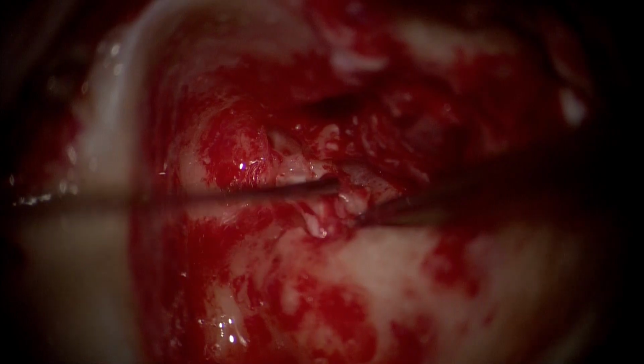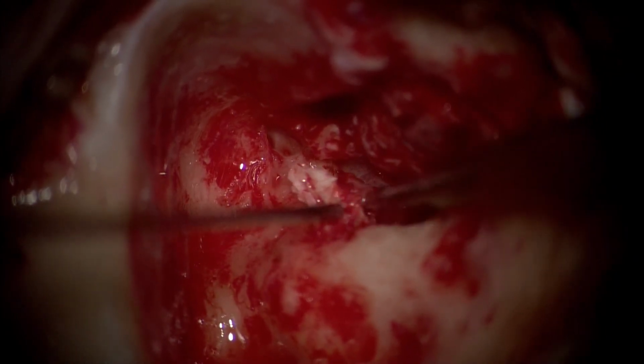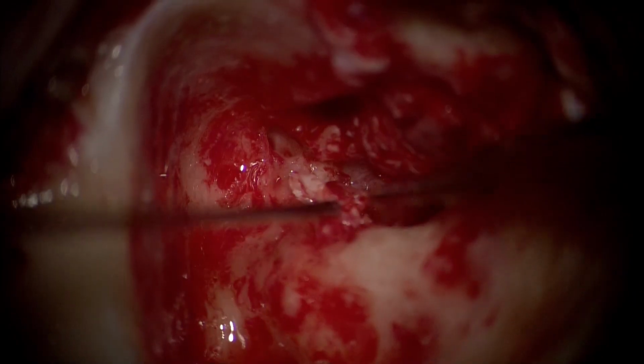This is to avoid traumatizing both the facial nerve as well as the oval window, because if inadvertently you use too much pressure or traction on the stapes region, then an intact footplate or intact stapes head can simply give way into a footplate fracture or, worse, an avulsion.